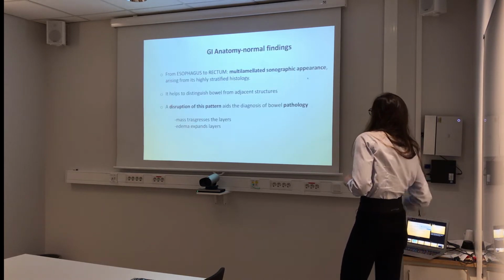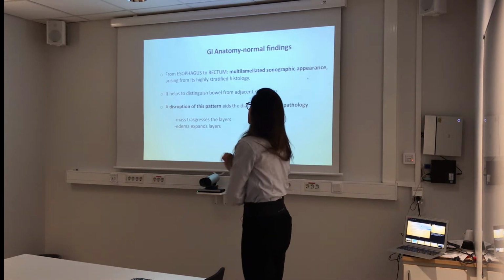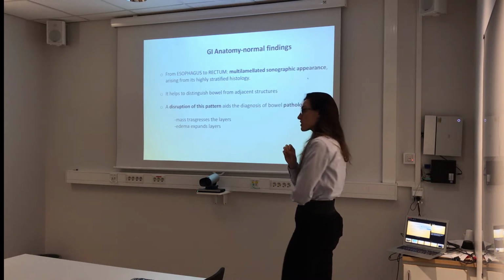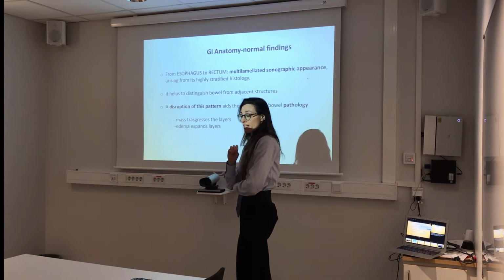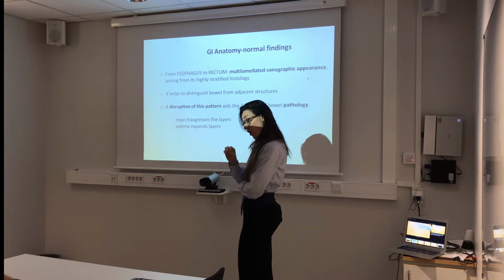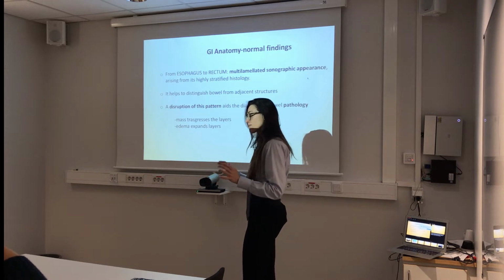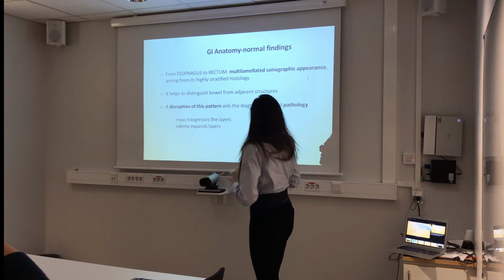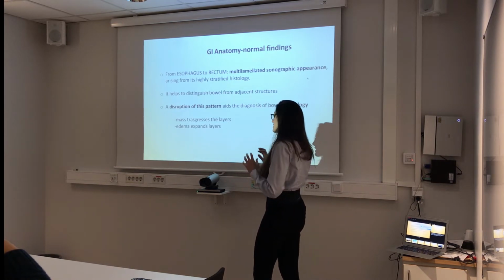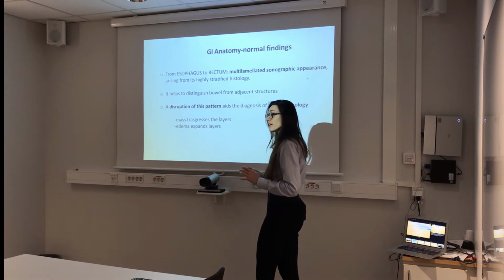Okay, SBO. Before talking about the SBO, let's delve a little bit into the gastrointestinal anatomy, to understand how the bowel looks, because this is one of the questions I receive from fellows every time. They ask me, but how do I distinguish the colon, for example the ascending colon, from the small bowel? So basically the big difference between the big bowel, so we are talking about the colon, and the small bowel is this.